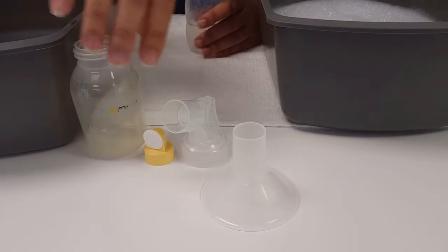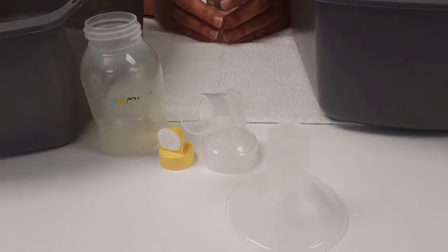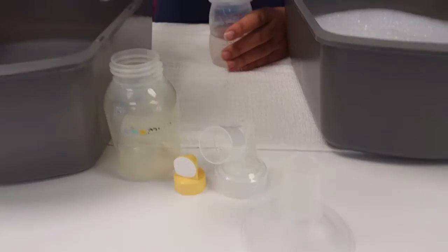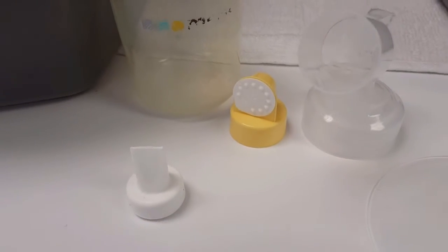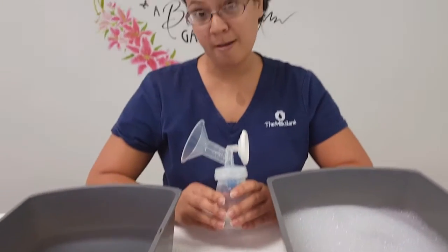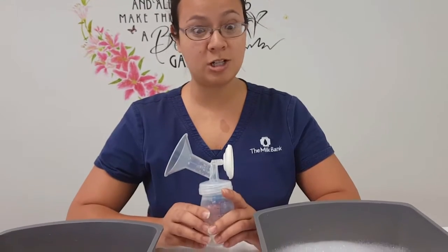So right here is the Medela style pump parts, and those tend to be pretty common around, so I just wanted to demonstrate that. And this is a different kind of valve, but this comes in the Ameda, so I definitely wanted to show the different membranes. So we'll get a nice close-up of those. And I have a Spectra pump, and I love my Spectra pump. It's nice and quiet and very efficient. So I'm going to show you how I take apart every little piece and wash it.